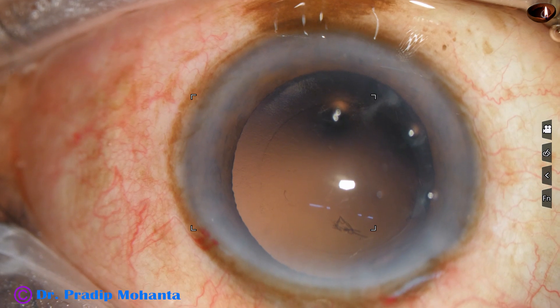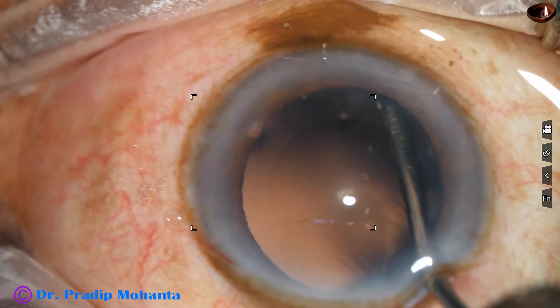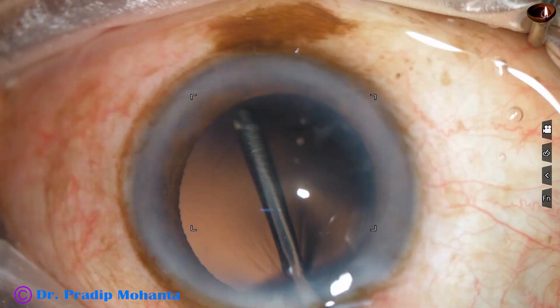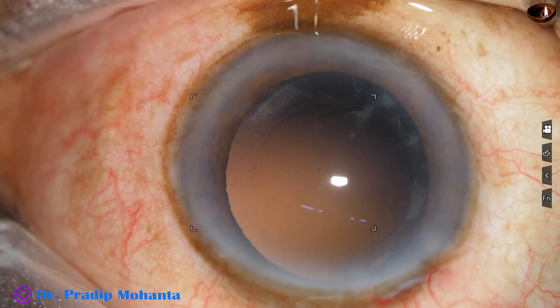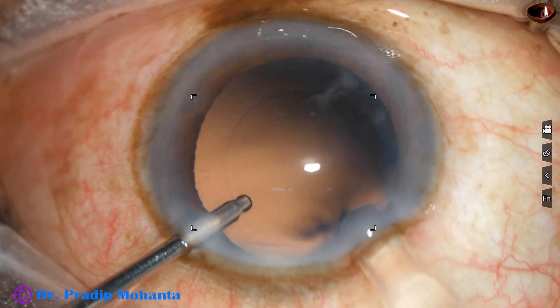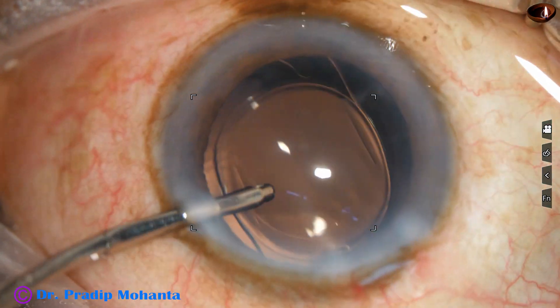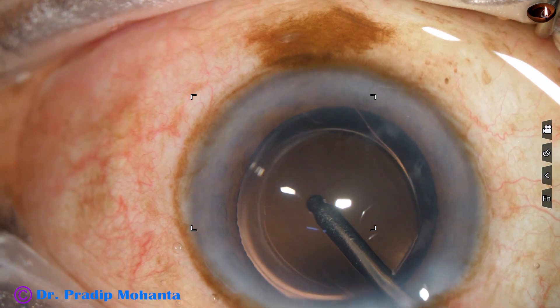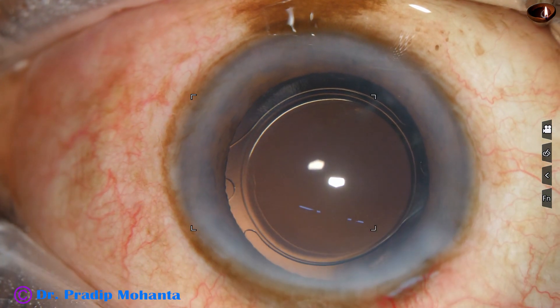Now it is time to implant an intraocular lens. I am going to do hydro-implantation. This is the irrigating probe of bimanual I&A. Hydro polish of the posterior capsule is done. There is a bit of fibrosis at the periphery of the posterior capsule at 7 o'clock — let it be like that. Here goes the intraocular lens through the 2.8 millimeter wound. The lens has gone into the capsule bag. Irrigation is done, and all the viscoelastic that was in the lumen of the cartridge comes out.